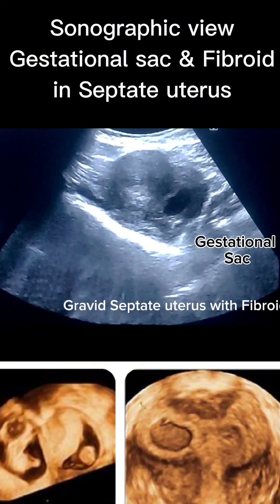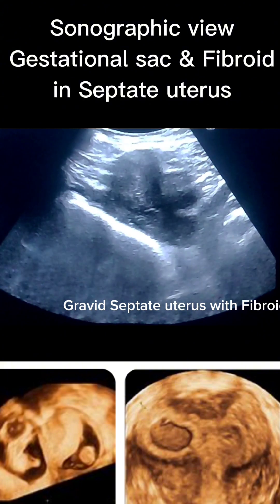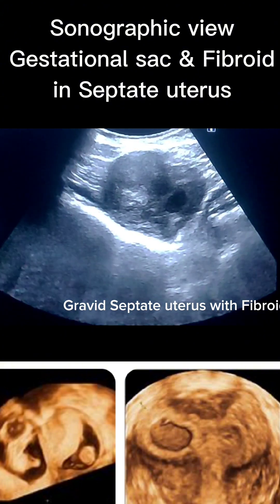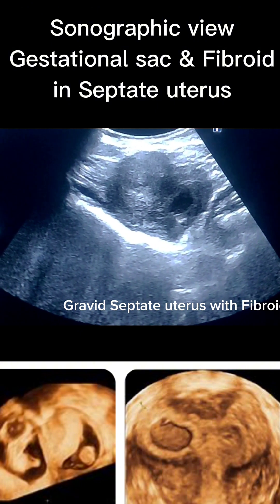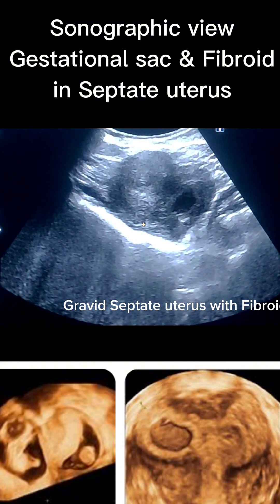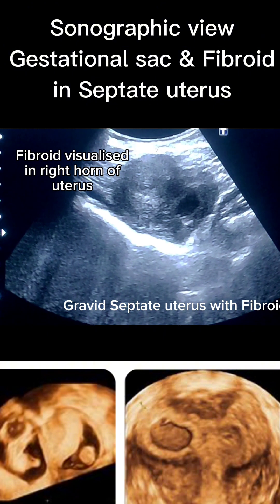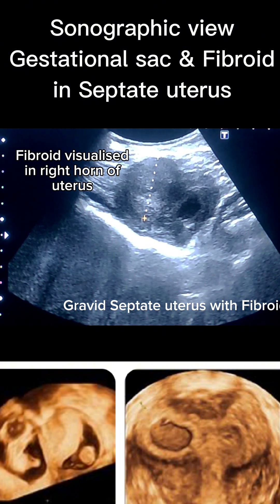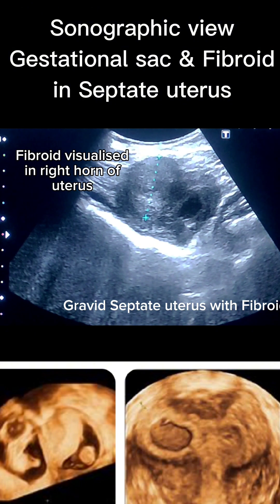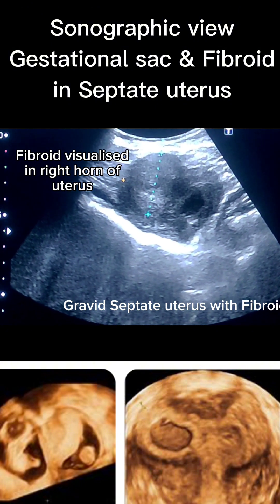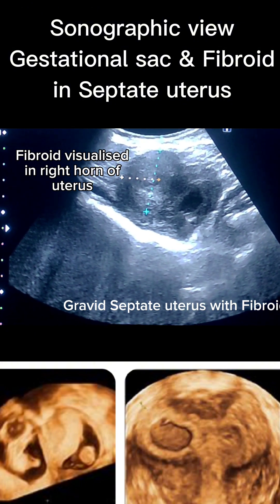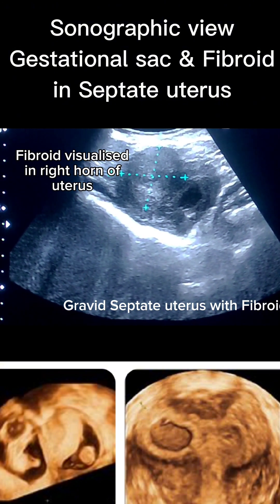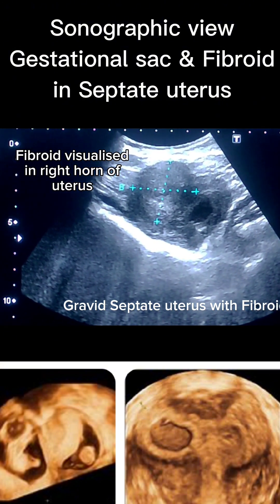In the right horn of the uterus, a well-defined hypoechoic mass is identified in the anterior wall, suggestive of a fibroid. It is homogeneously hypoechoic, located in the anterior myometrium near the fundus of the right horn. No internal vascularity or degeneration was seen on color Doppler.